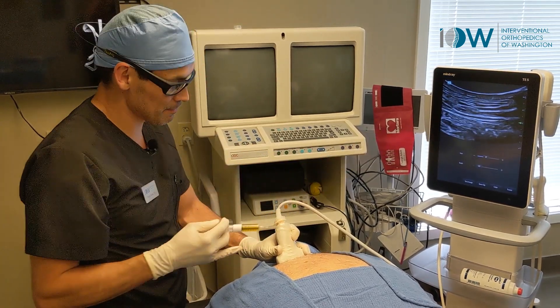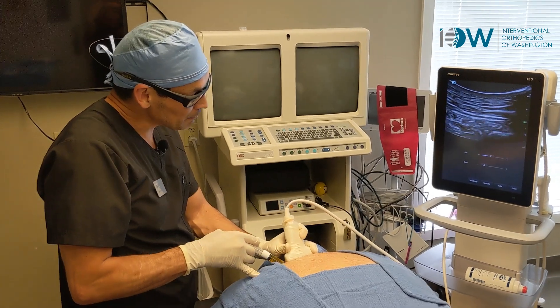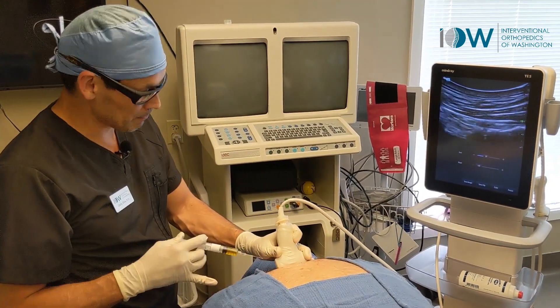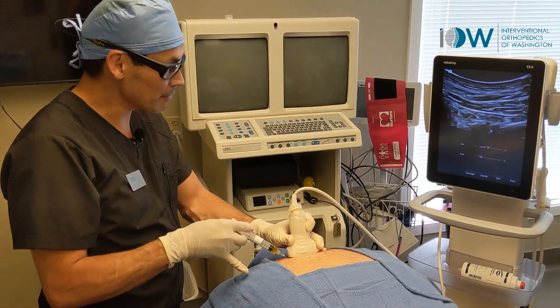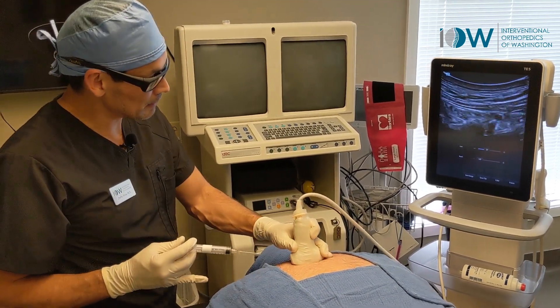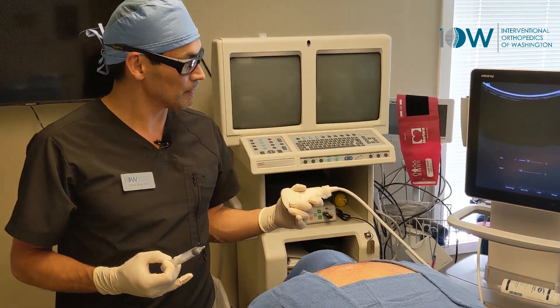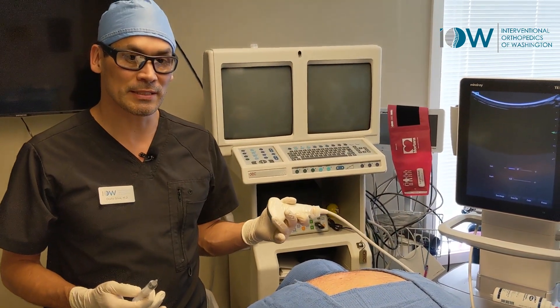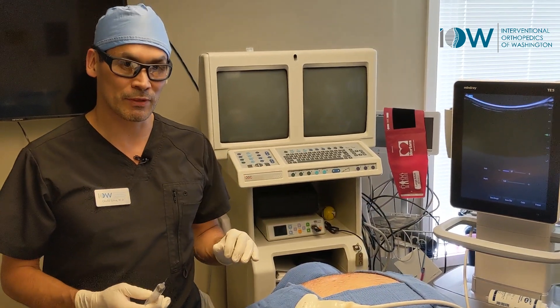So we're looking at that joint space there. We'll follow up in another four to six weeks and see how he's doing. This should help with some of that rib pain.